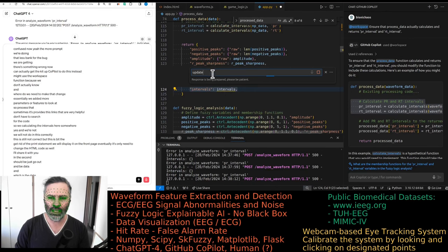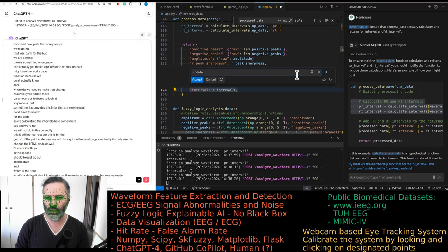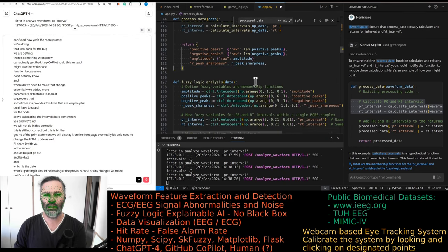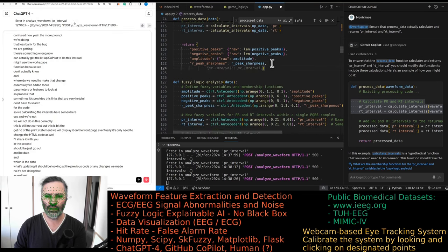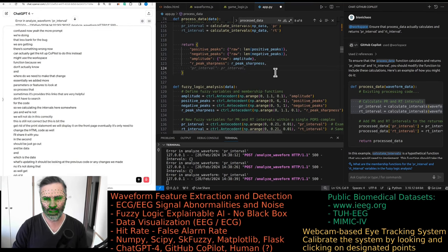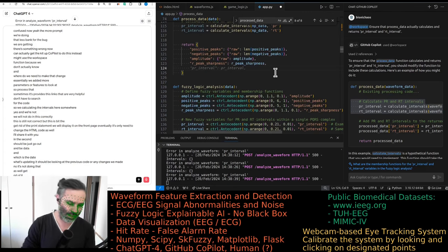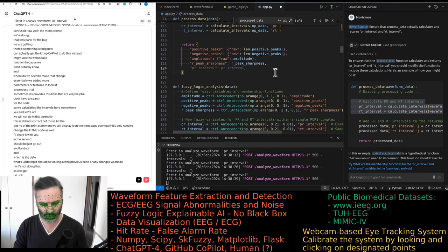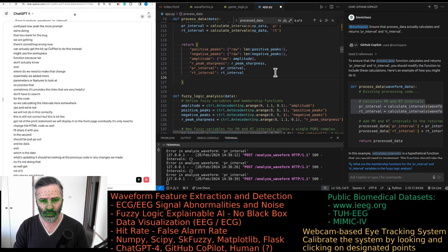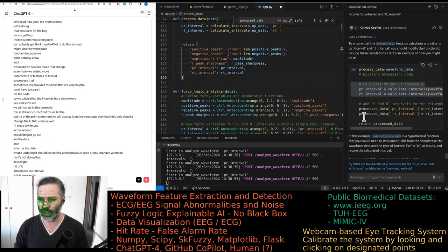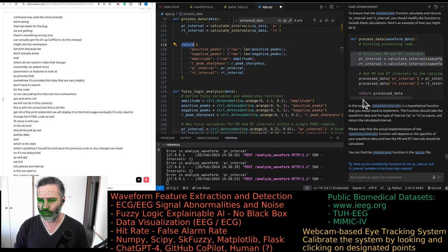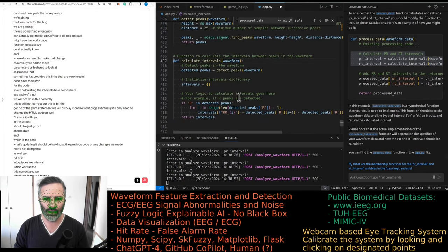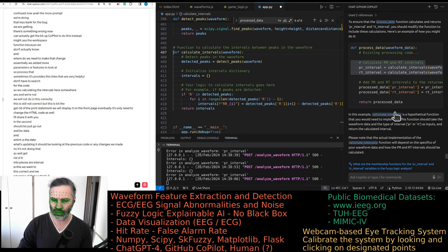When it's updating, it should be looking at the previous code or any changes we made. No, it's not doing that. Let's get rid of it. Print interval. Sorry, PR interval. Yes, that's what we want. And QT interval. This is correct. And we're returning all that. So that's fine. Calculate intervals. It's not a hypothetical function. It's an actual function.